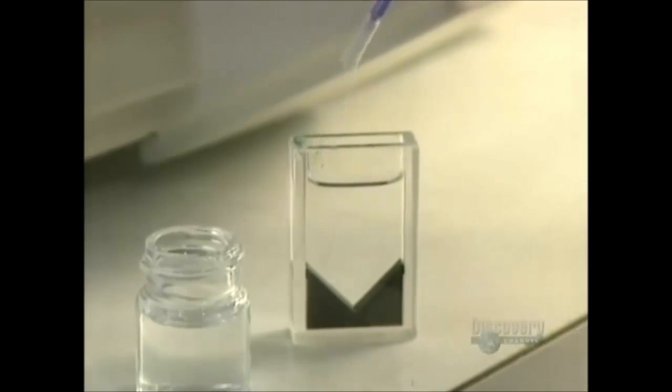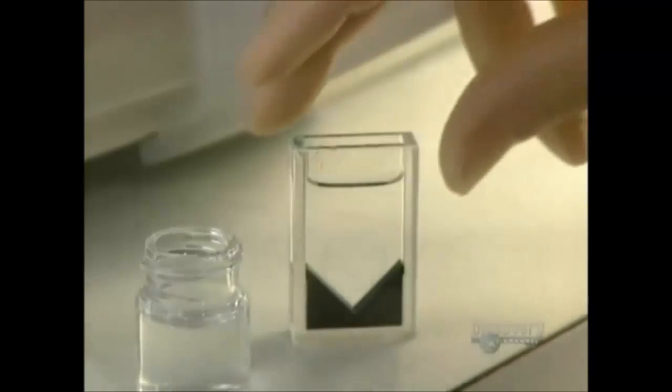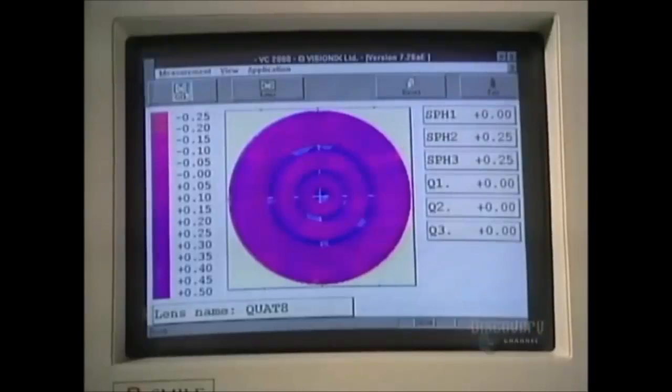This optical topographer is used to verify, through color distribution, whether the spread of optical power in the lens is precise enough to ensure perfect vision.